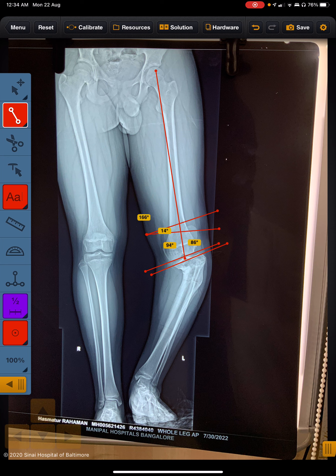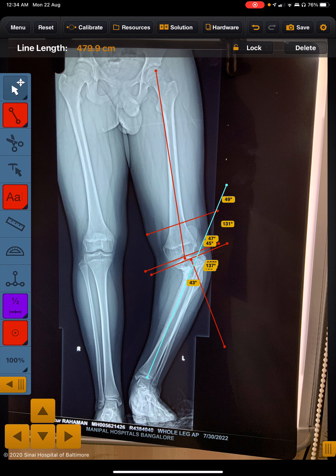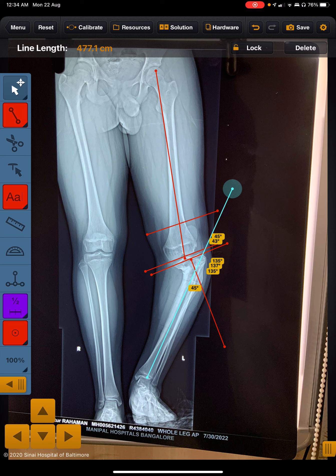This is the line perpendicular to the joint end of the tibia, and this is the line along the mechanical axis of the tibia. As you can see, it is around 45 degrees at this moment. We will be calculating all of this one by one.